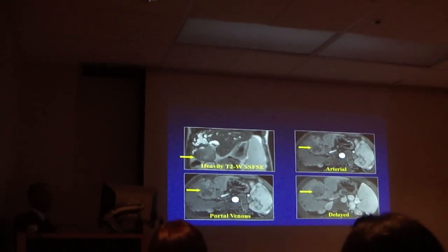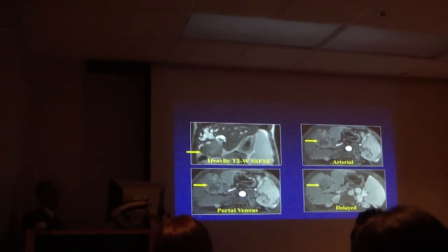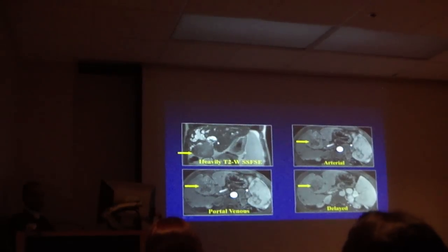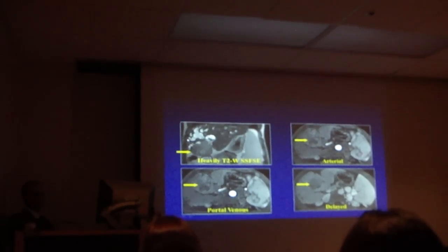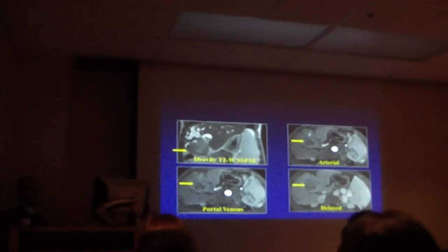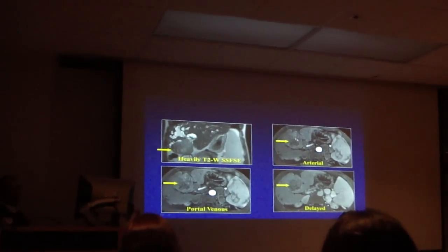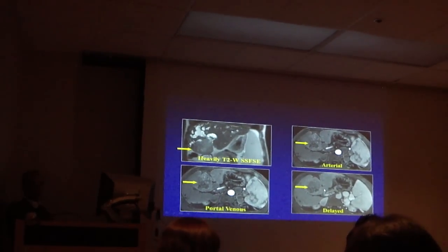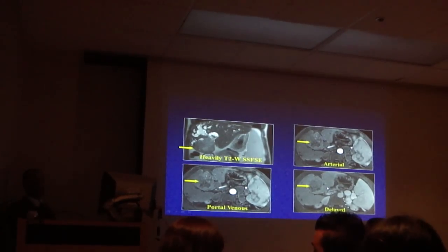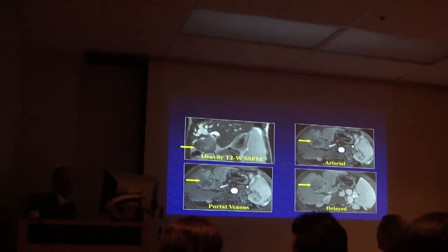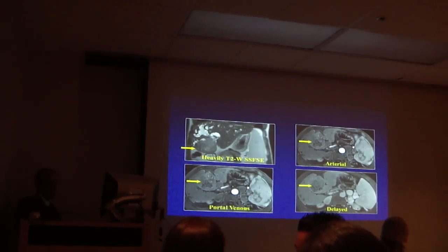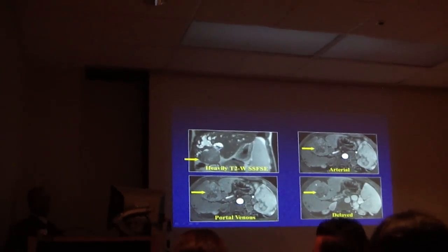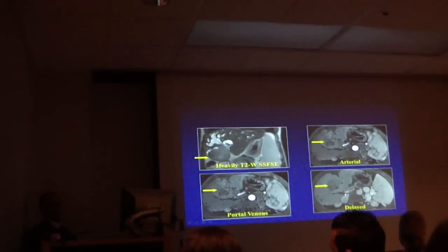On T2-weighted images you see the lesion, and you also see intrahepatic biliary dilatation on the coronal image. The lesion is heterogeneous and remains heterogeneous. The lesion remains ill-defined and progressively fills in on delayed phase. There are other lesions in the liver as well.